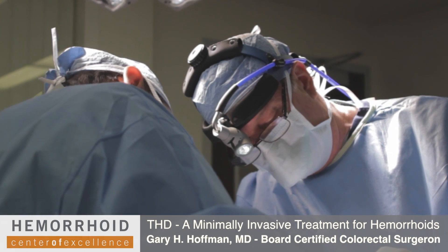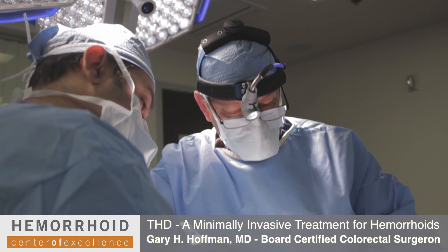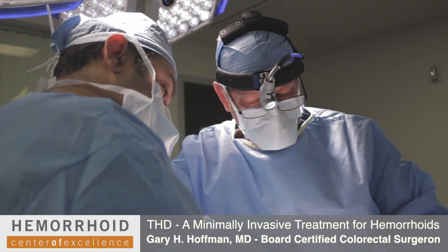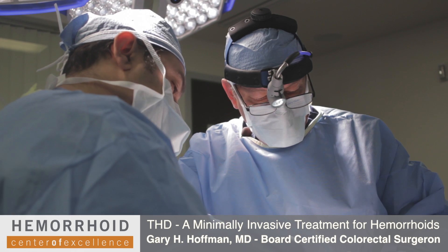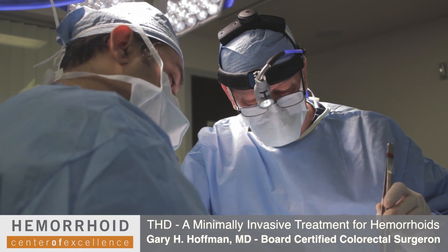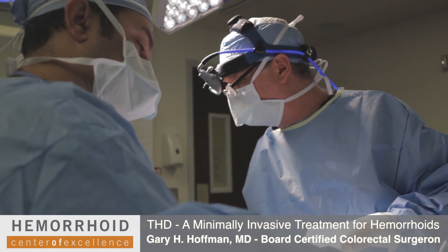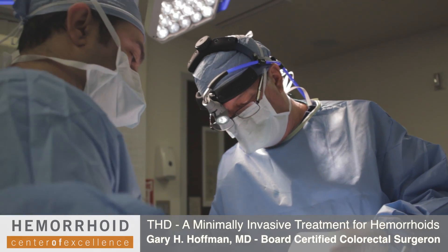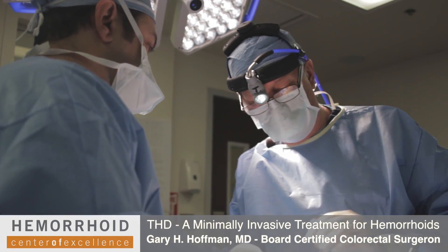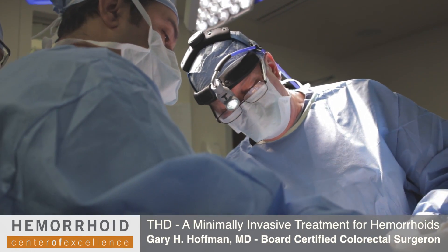Our results today have been very good. One of the main differences between THD and PPH is that in a PPH, once the instrument is inserted, tissue is actually removed. There are many circumstances where this has to be performed. But one of the advantages of THD is that no tissue is removed. However, THD is not applicable to all cases, nor is PPH.